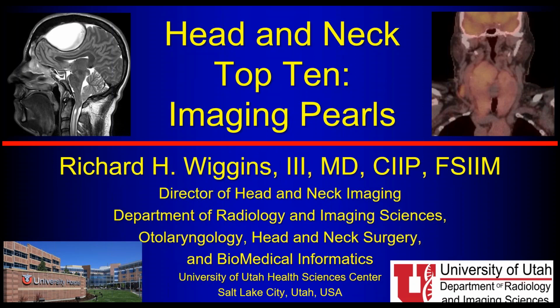Throat. So what I do is I have the patients hold their breath with their lips closed. So they're doing a puffy cheek. If somebody says to me that they're interested in the buccal surface, the retromolar trigone, the tip of the tongue, the gingival lingual, the gingival buccal sulcus, any of those areas, I think about doing the puffy cheek as a second pass. So I just tell the patient to hold their breath just for a couple of seconds with their lips closed and puff out their cheeks like they're playing a trumpet. And then I do a quick short pass through the cheeks.